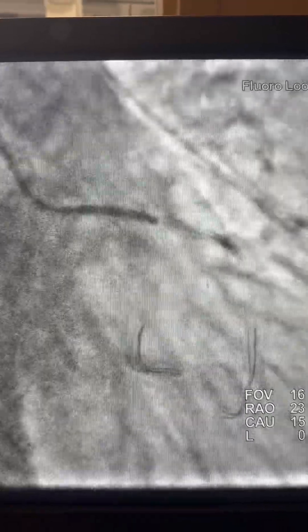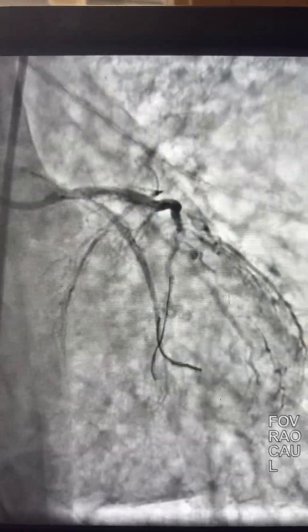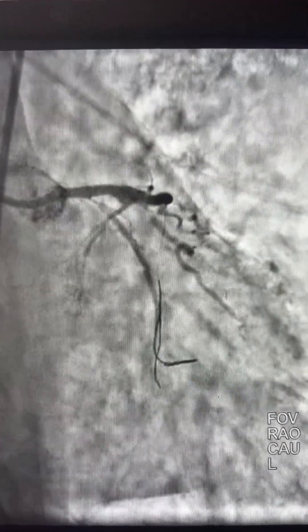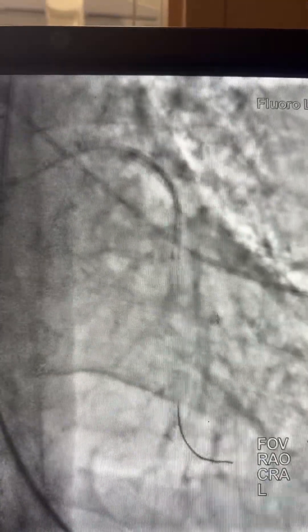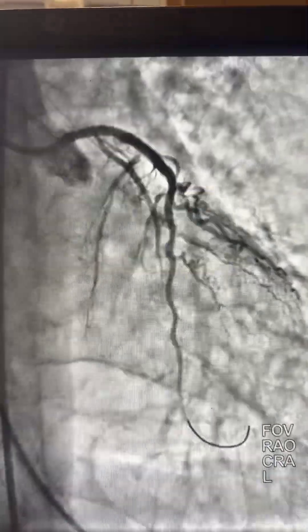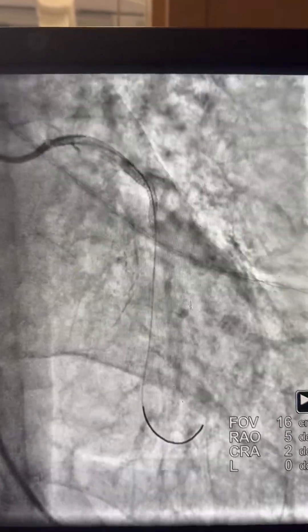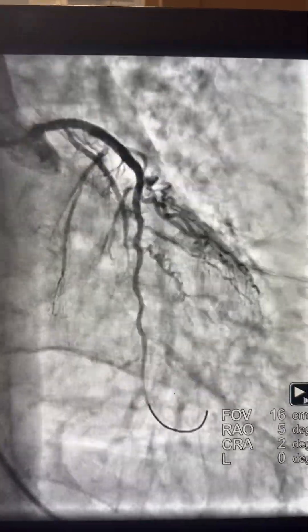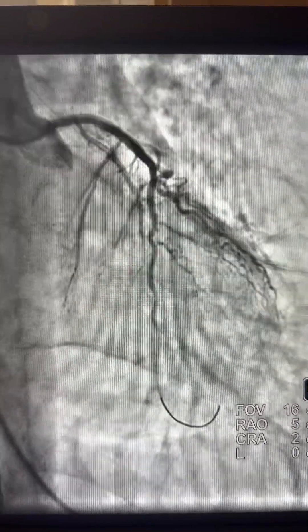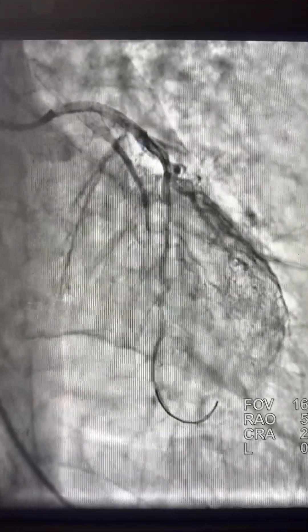Still doing CPR, we inflate those stents. Here is the angiogram after — flow is still not the best, so I opted to do a Pronto LP aspiration right away, fast. Here is the angiogram after, and we now have good flow in the LAD. We've established flow in the LAD and the LCX as well.